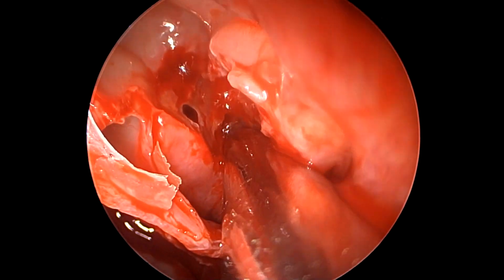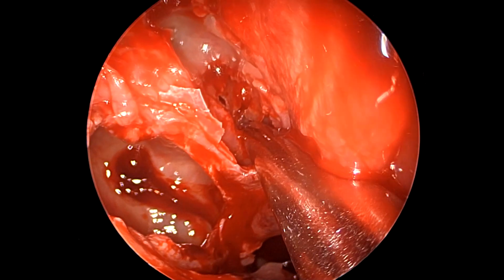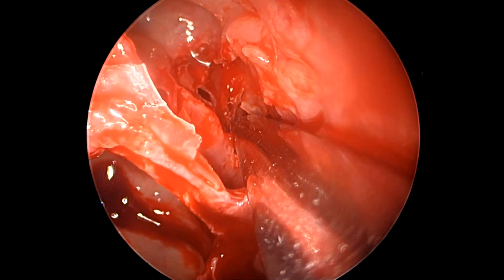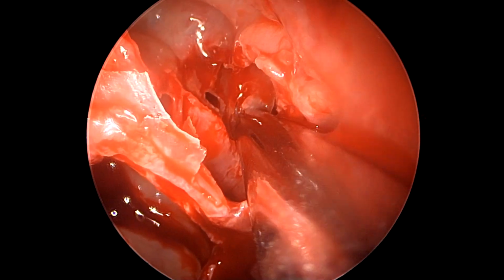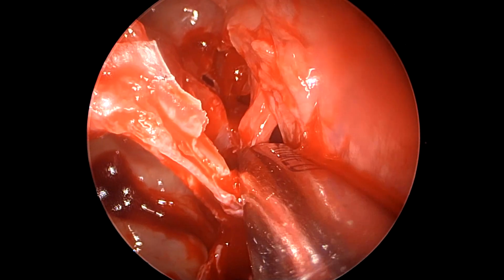We must also understand that the skull base starts to slope downwards from anterior to posterior, and the orbit starts to curve from lateral to medial as we go posteriorly. So one must be mindful of those trajectories, as the working space becomes slightly restricted from anterior to posterior, and that has to be borne in mind.